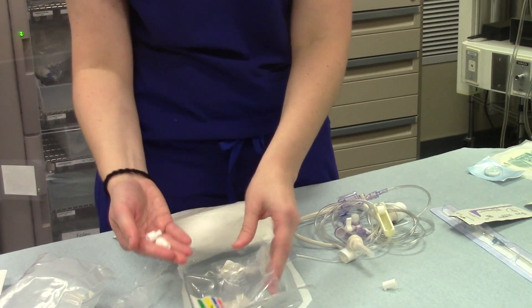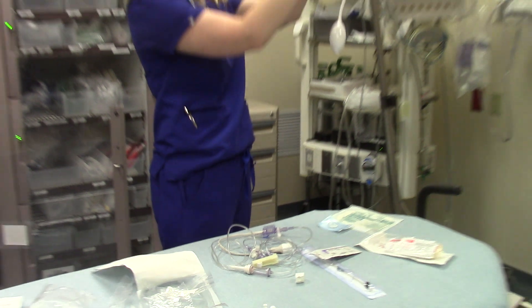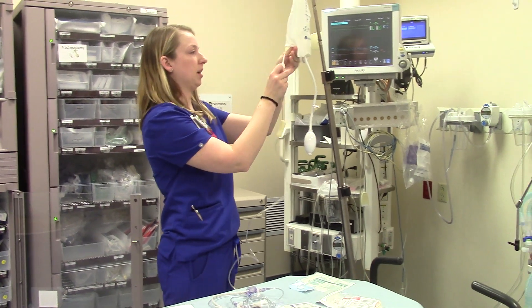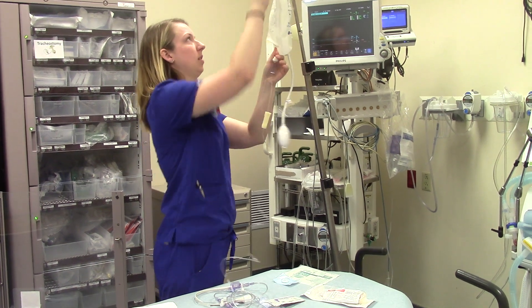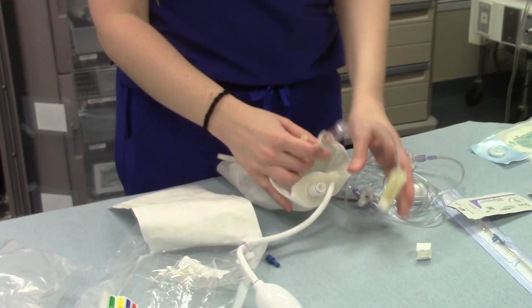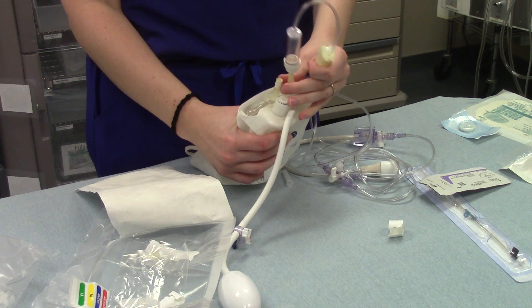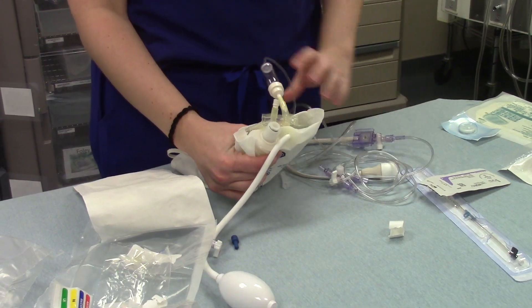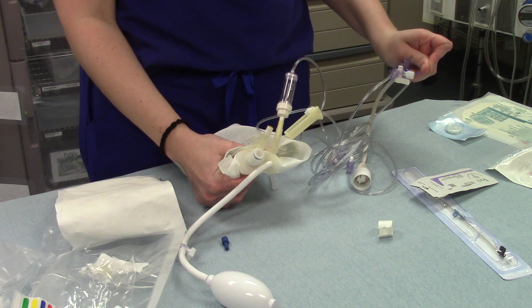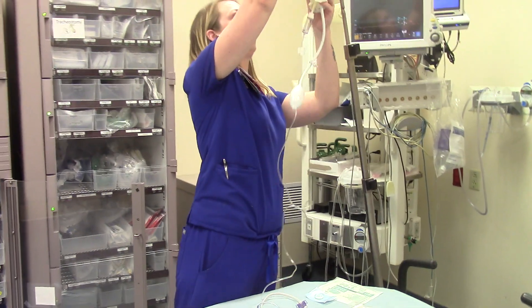Go ahead and open those up and get your kit set up. Go ahead and clamp off your roller clamp and spike your bag of saline. One step you need to remember to do is you actually need to burp your bag — usually they'll have air in them. So you're going to open up your clamp and just squeeze the air out of this bag. It's a little tricky because you have to do it and also hold the spike. Do it until you can get it to start dripping saline in there, and once you get that air out of the bag, you can go ahead and prime the rest of your art line setup.